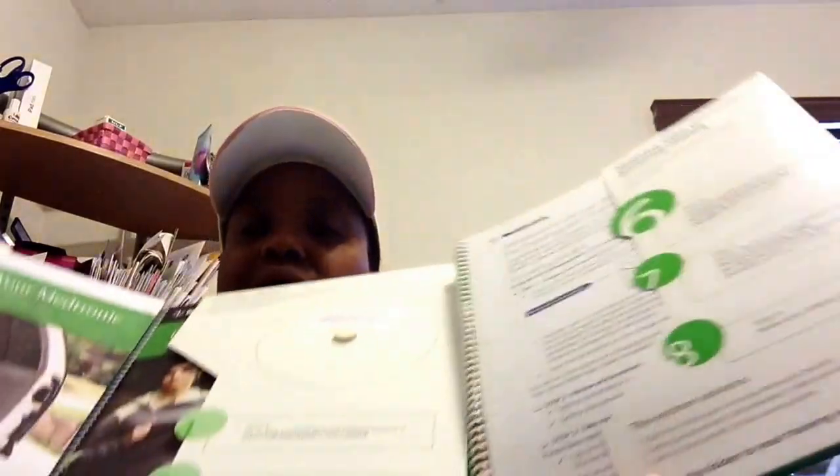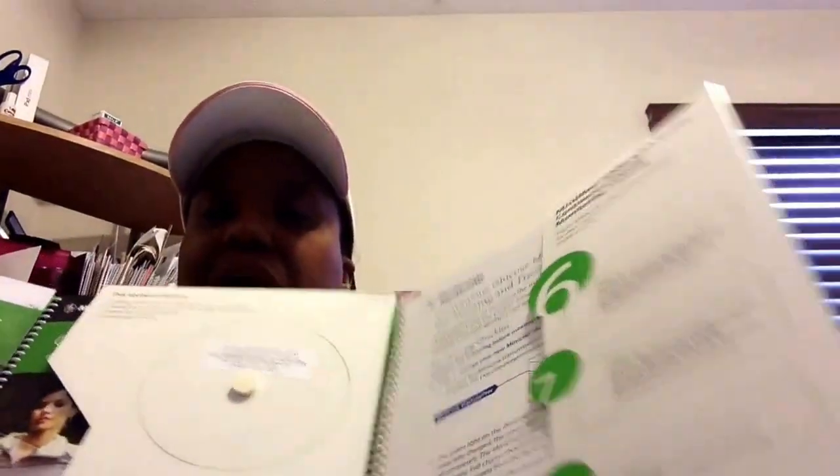I also received the MiniMed with Enlite training manual — it's a three-part set. They used to include a CD, but now they've gone techno and everything's online, which is a good thing. I'm glad they did that because we waste a lot of plastic and paper in this world. I wish they could just make it all a nifty booklet without all the extra stuff.